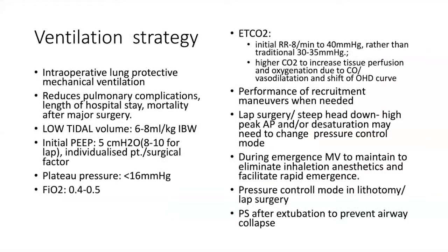The ventilation strategy: intraoperative lung protective mechanical ventilation is done. It reduces pulmonary complications, length of hospital stay, and mortality. Usually a low tidal volume of 6 to 8 mL/kg ideal body weight, and initially PEEP of 5 centimeters, or for laparoscopic surgery 8 up to 10 can go.